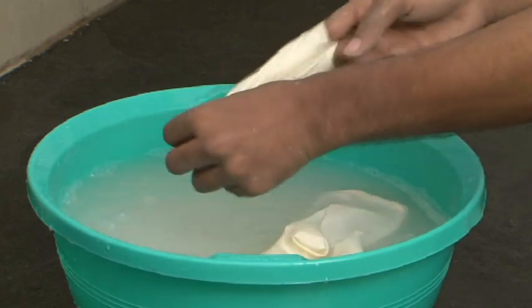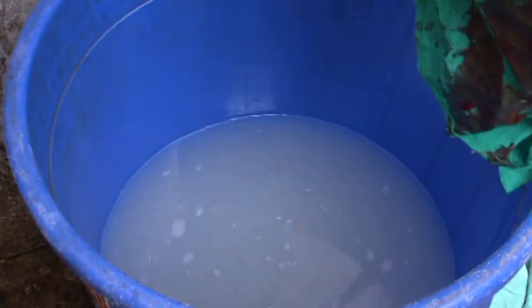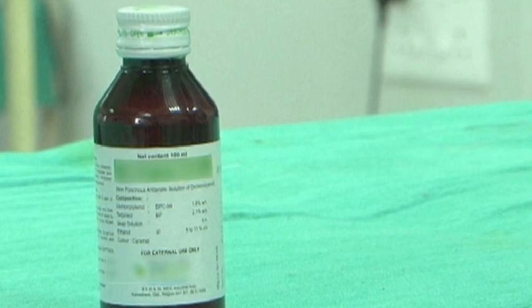Decontaminate the gloves in chlorine solution. Do not throw them on the floor. Do not throw the soiled linen on the floor. Disinfect it with chlorine solution followed by washing and autoclaving. Mop the floor every 3 hours with disinfectant solution.